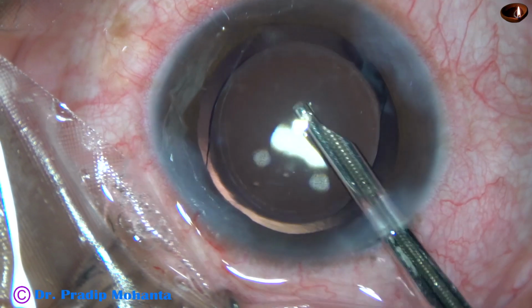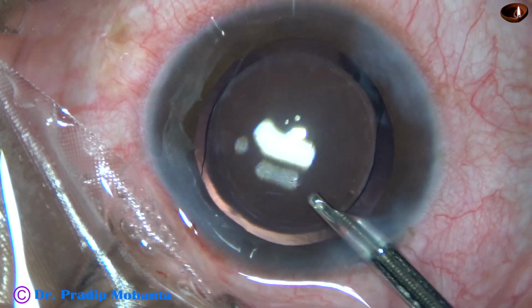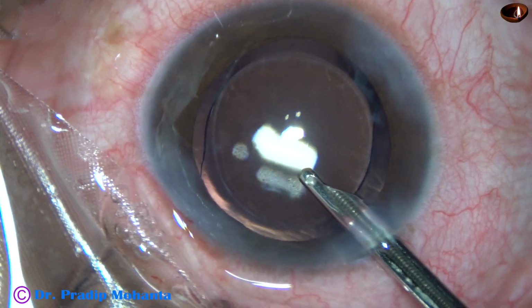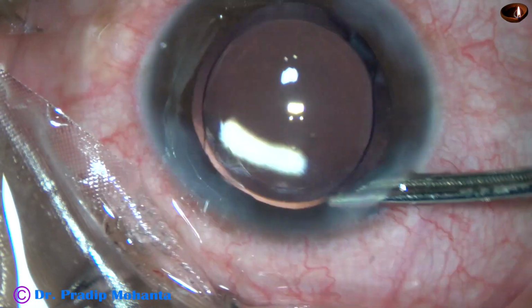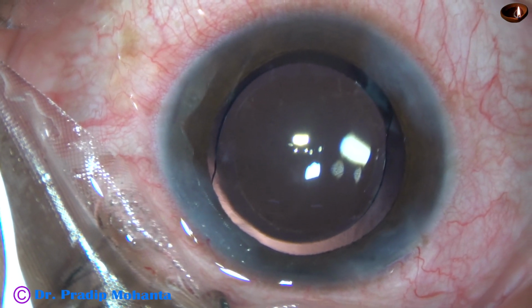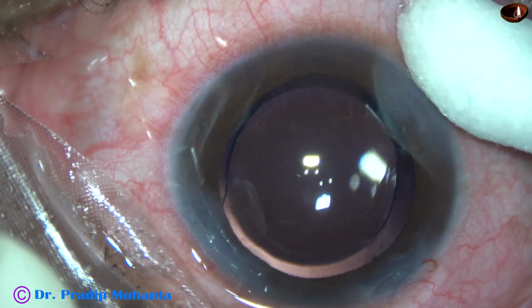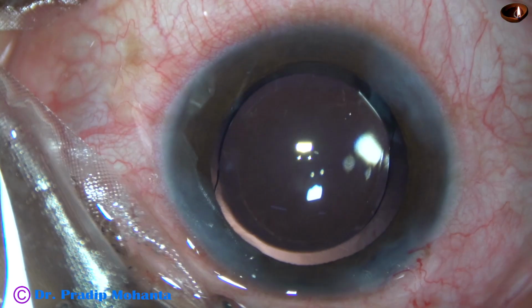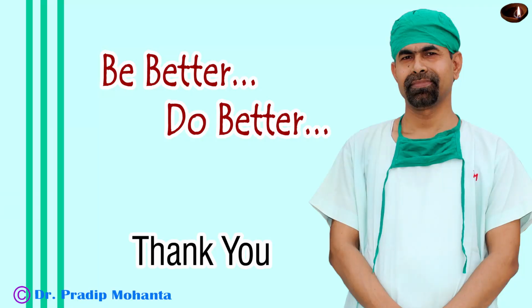And this is the final lavage with a pure BSS. I inject moxifloxacin. Most of the moxifloxacin is washed out, but whatever remains behind the IOL is enough to control infection. The integrity of the wounds is checked, a few drops of moxifloxacin are applied, and the case is concluded.